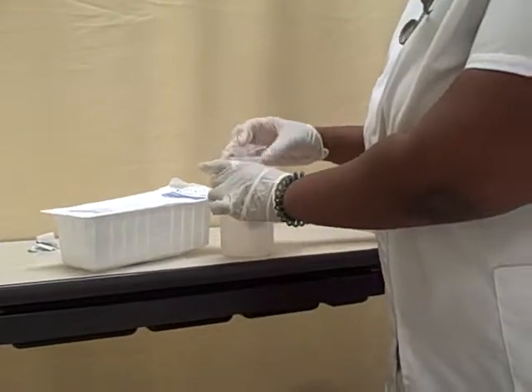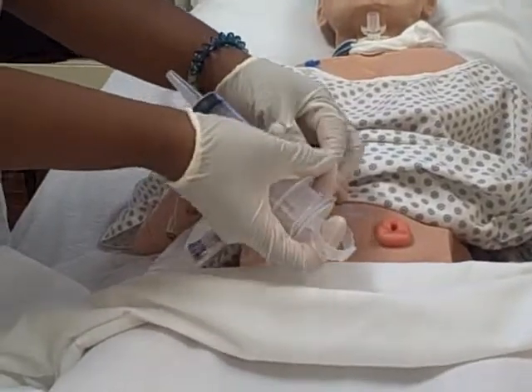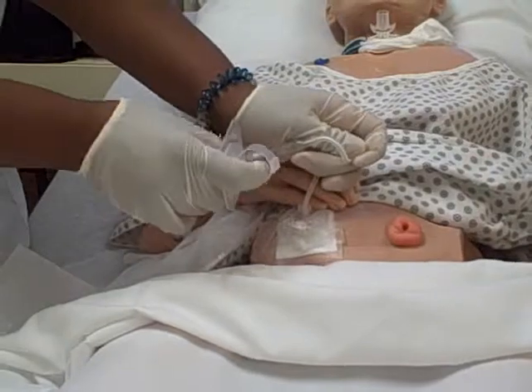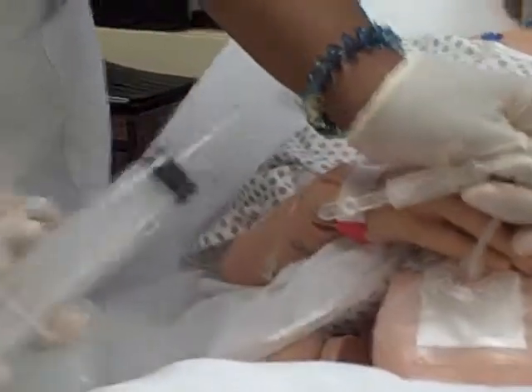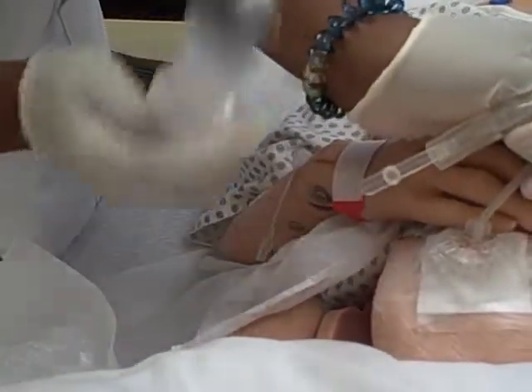Okay, so I want to get the syringe, kink the tube, remove the pump feeding. I'm going to insert this in the PEG tube.